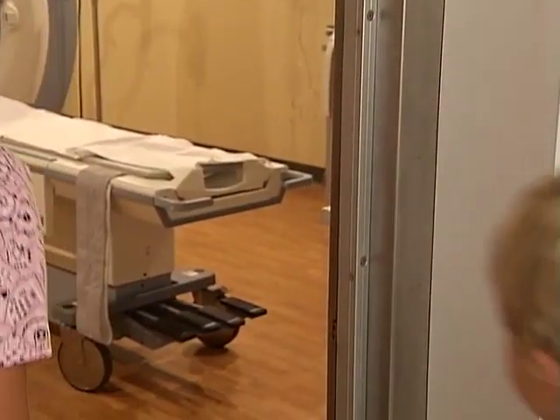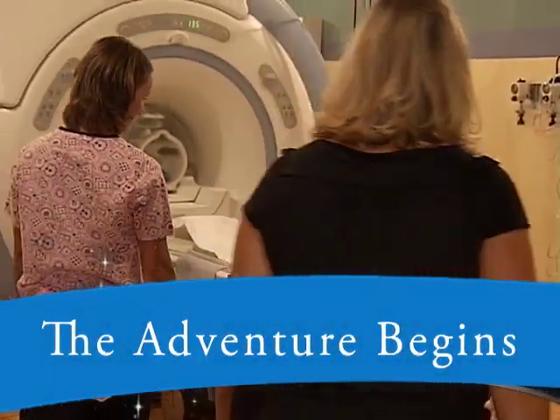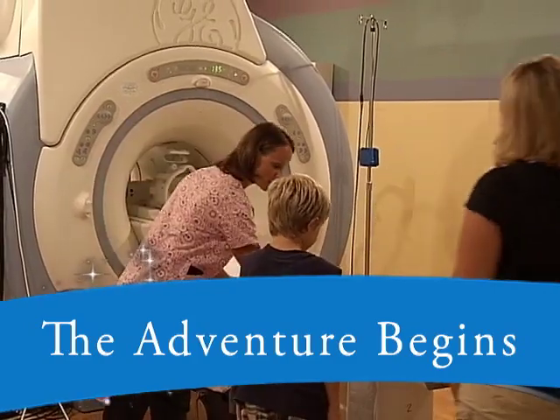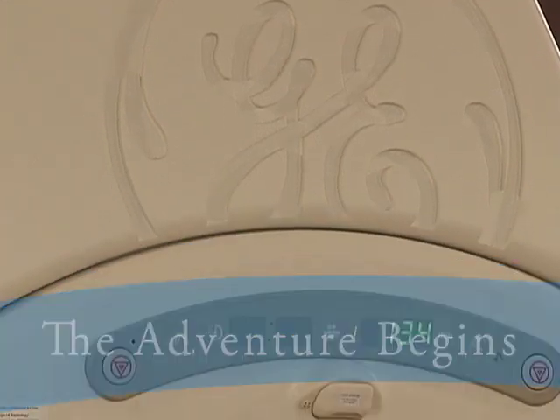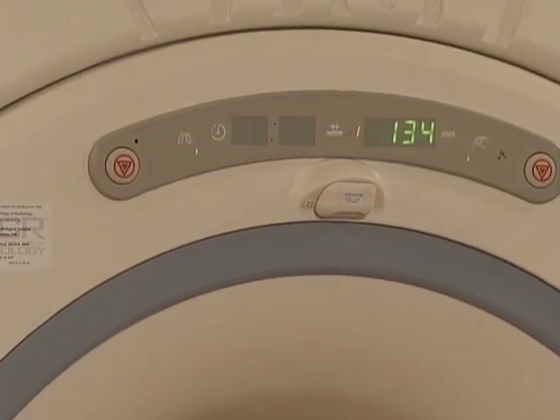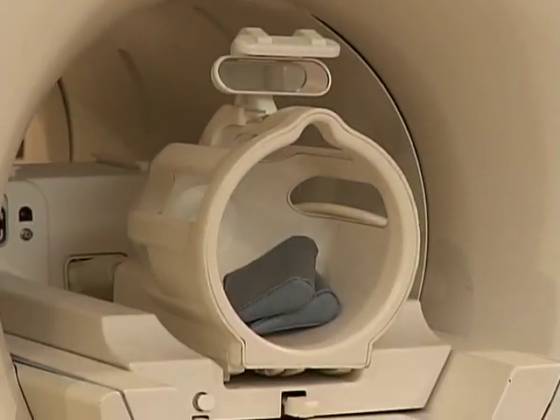Next, your nurse will take you and your family member into the MRI suite where the adventure will begin. Before getting started, take a look around. The camera is very big and is made out of hard plastic. The magnets are deep inside, just like the film or memory card in a camera.